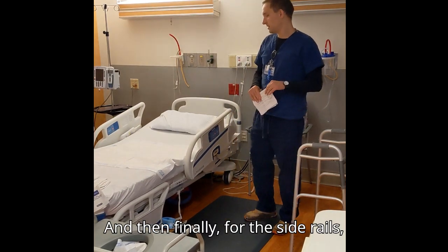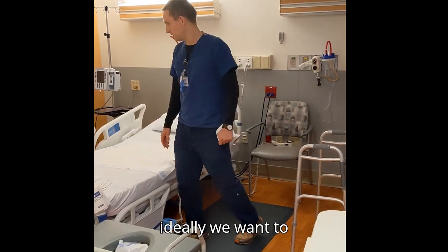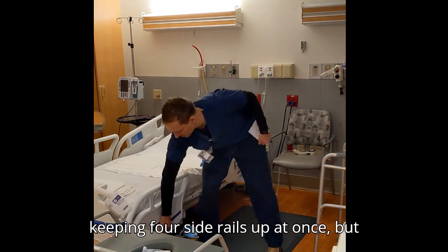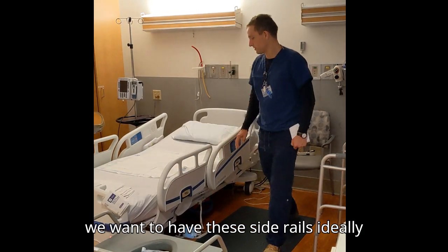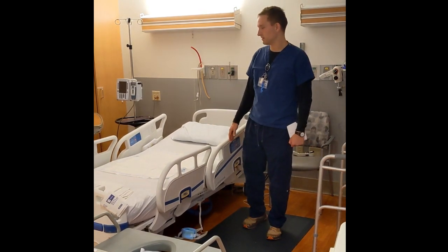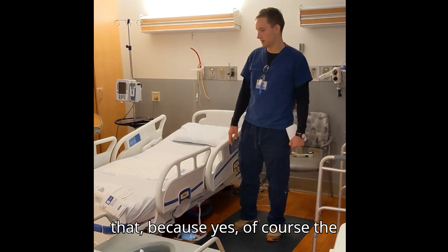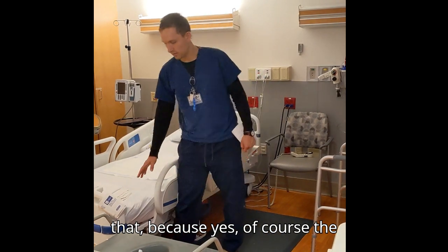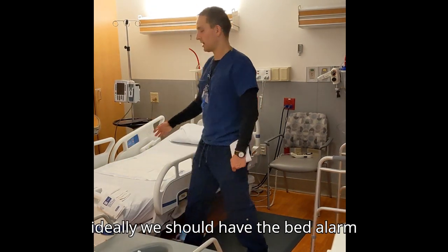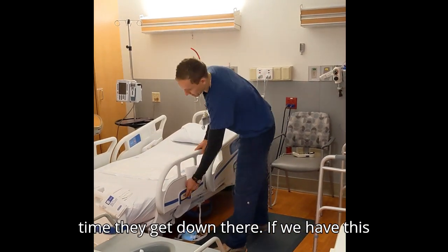And then finally, for the side rails, ideally we want to have these. Now, of course, we're not keeping 4 side rails up at once, but we want to have these side rails ideally close together like this, as you can see on this side, because yes, of course, the patient could slip out here, but that's kind of at the head of the bed, and ideally we should have the bed alarm already going off by the time they get down there.